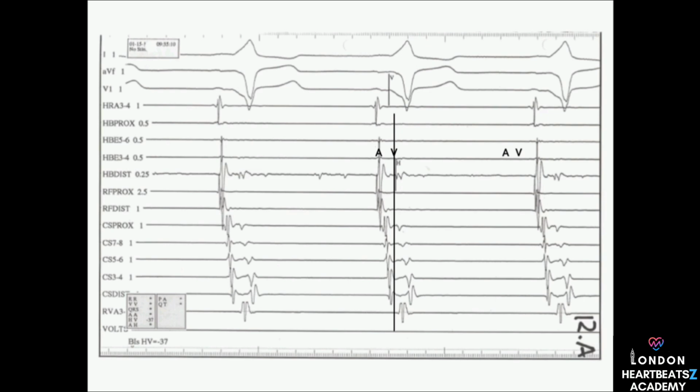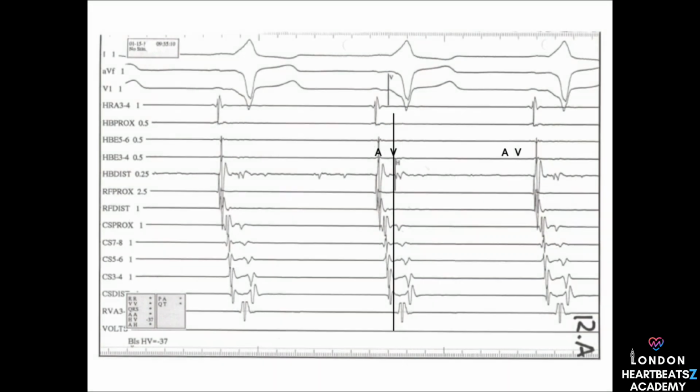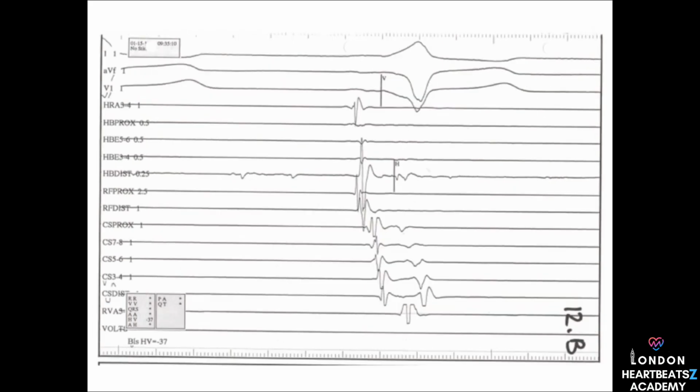Exactly. Okay, so figure 12A, this is showing sinus rhythm, the normal heart rhythm, but we can see evidence of that right-sided accessory pathway. We see a delta wave, that's a slurred upstroke on the QRS complex, and the earliest ventricular wave is happening at the His bundle, which tells us it's not a left-sided pathway. Okay, so the delta wave and that early ventricular activation, those are clues that the pathway is on the right side. What else are we seeing? That negative delta wave in lead V1, that's another clue. And a short HV interval, minus 37 milliseconds, that confirms pre-excitation. So lots of signs pointing to a right-sided pathway.